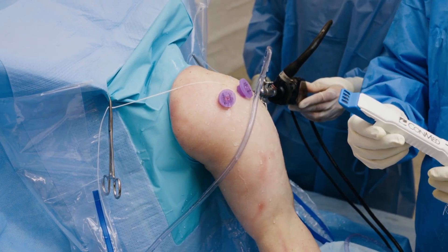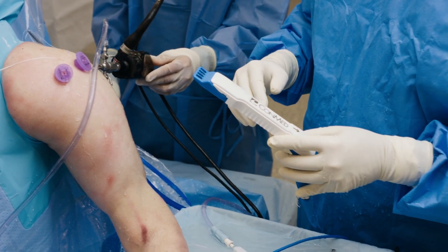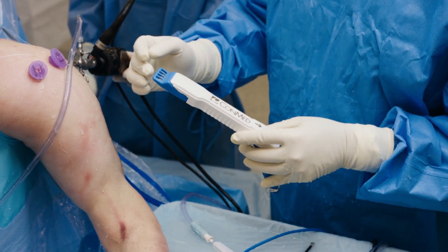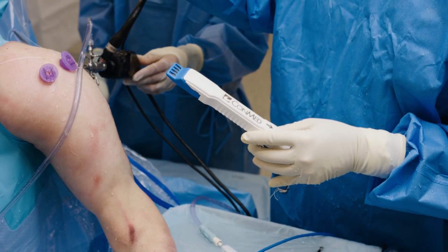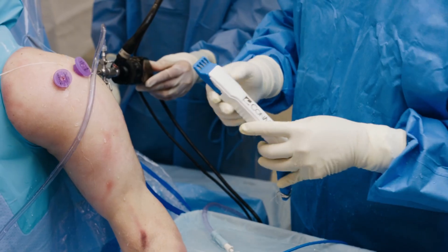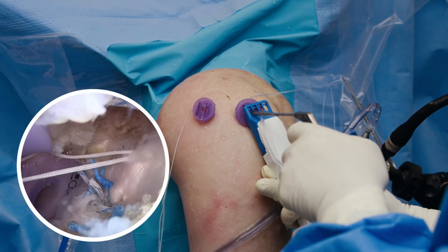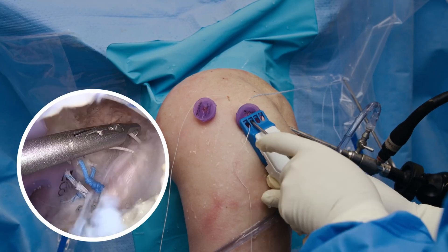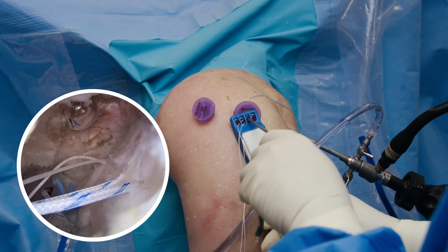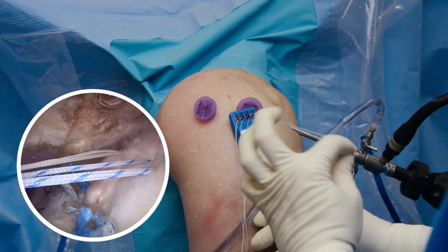We're going to take the biobrace RC, which comes in multiple different sizes to accommodate different cuff repair configurations and options for fixation. What we're using here allows for four medial sutures — that's what we have with the two white limbs and the two white-and-blue limbs in the posterior aspect of the shoulder. We're going to hold that over our cannula, and in a sequential fashion we're going to grab the white sutures and then the blue-white sutures going through the corresponding suture organizer hole within the biobrace RC device.